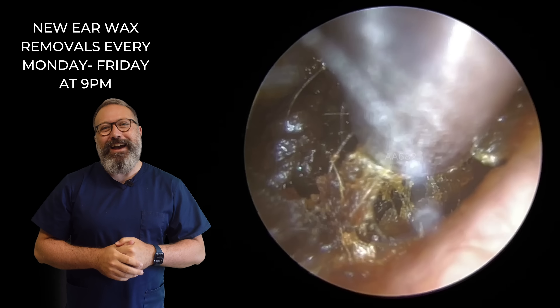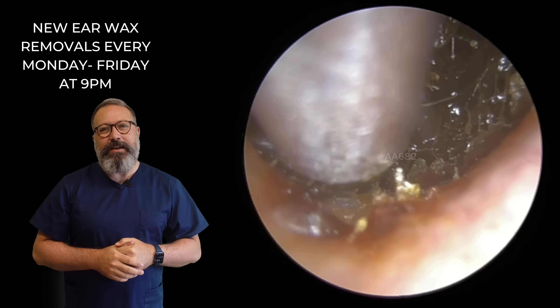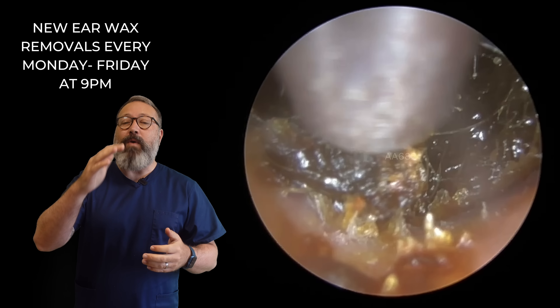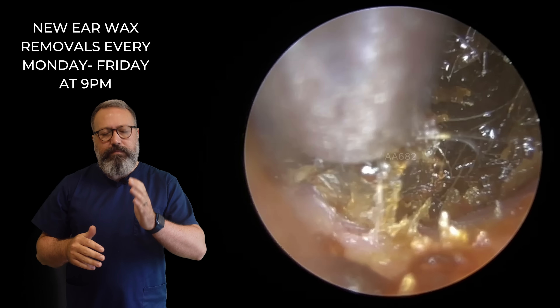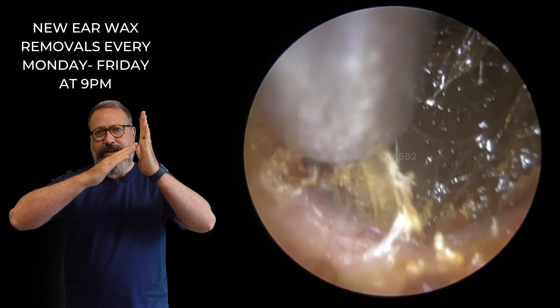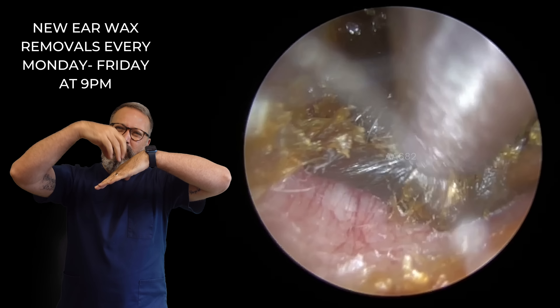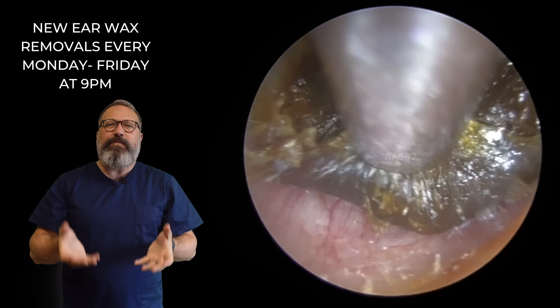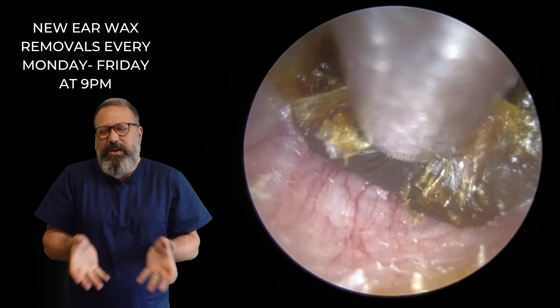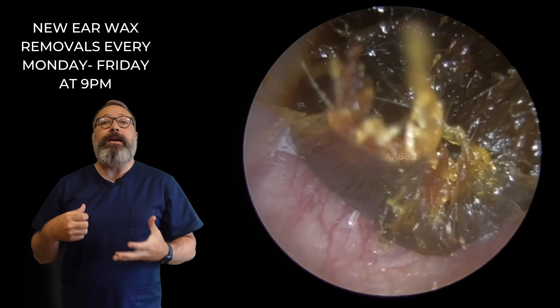So we just managed to detach this from the canal wall — there we go, just lifting up from the sides. Now what's happened here is the wax has actually formed on a slope. Imagine this is your eardrum, so it's sloping up like this at the front end, which means we can't get a great suction grip because the angle's just wrong — we can't quite get on top of it. So we're having to lift from the bottom first of all just to bunch it all up in the centre, and then we can get a good grip and pull that out.